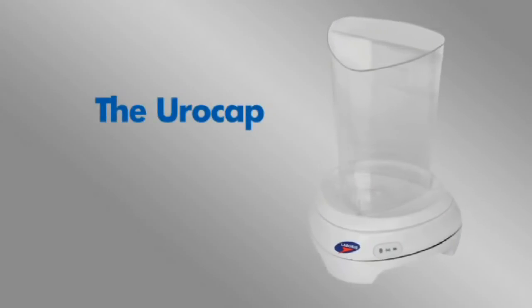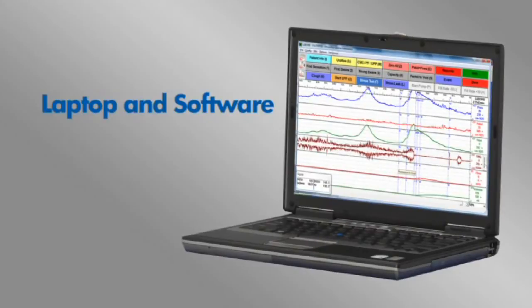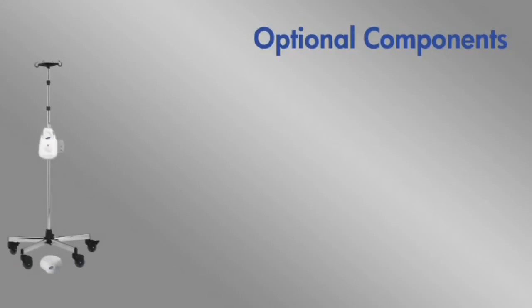The Urocap IV to measure uroflowmetry, as well as a laptop for running the studies. The Goby also offers the following optional components.